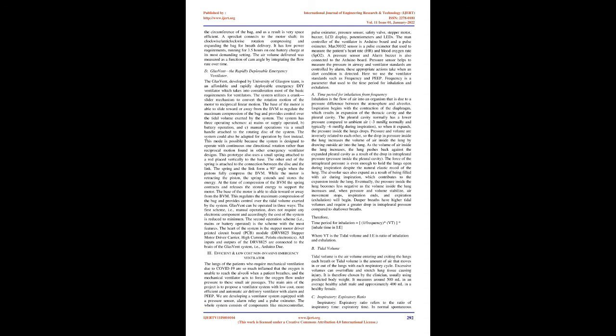Design and prototyping of a low-cost portable mechanical ventilator. This paper describes the design and prototyping of a low-cost portable mechanical ventilator for use in mass casualty cases and resource-poor environments. The ventilator delivers breaths by compressing a conventional bag valve mask, BVM, with a pivoting CAM arm, eliminating the need for a human operator for the BVM.